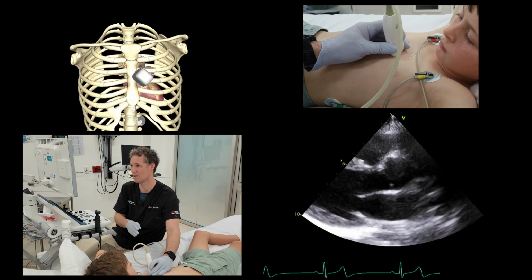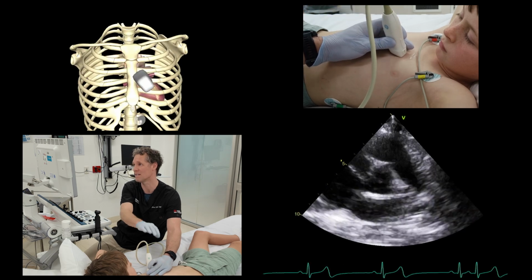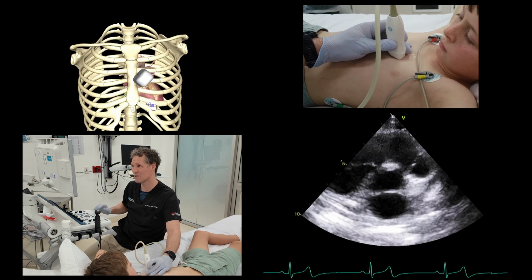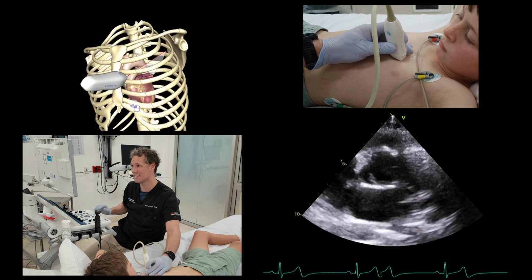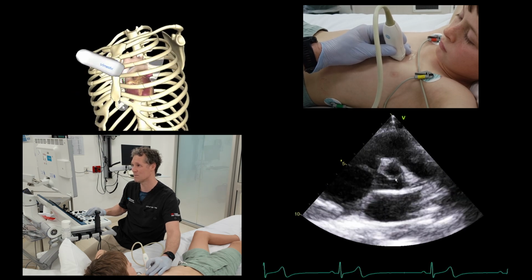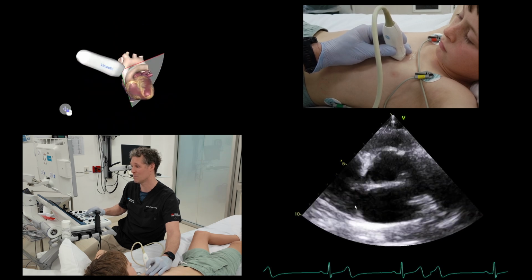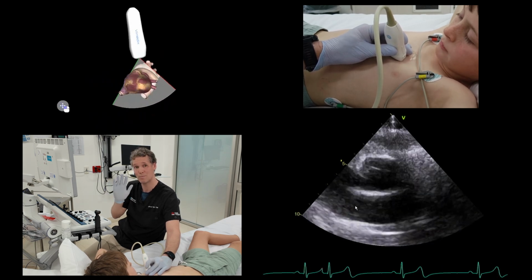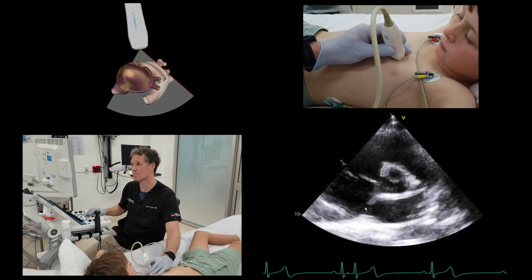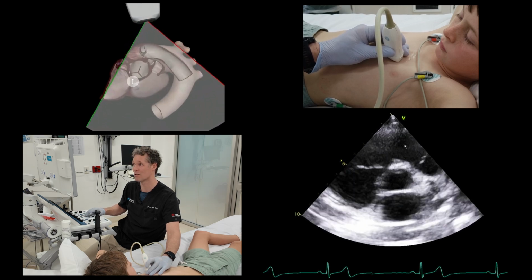Put that aortic valve into the middle of my screen, and I rotate my probe around, so the aortic valve stays in the middle of my screen at the top. I'm going to do tiny little circular movements, just trying to nestle into that intercostal space. And here I can start to make my assessment. There's my aortic valve, left atrium, right atrium. That interatrial septum in the middle, trying to determine if it's bowed one way or the other, showing signs of significant raised pressures. There's the tricuspid valve, and there's the pulmonary valve with the right ventricle in between.